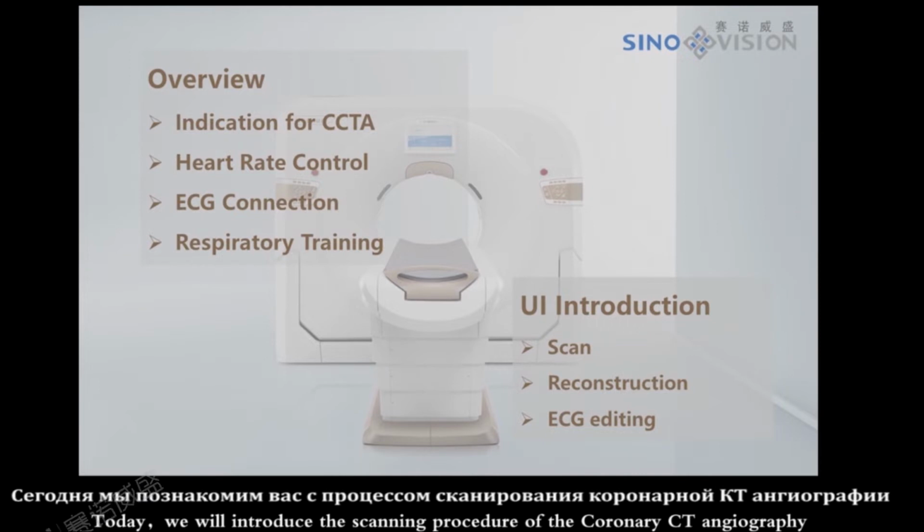Today, we will introduce the scanning procedure of the coronary CT angiography.